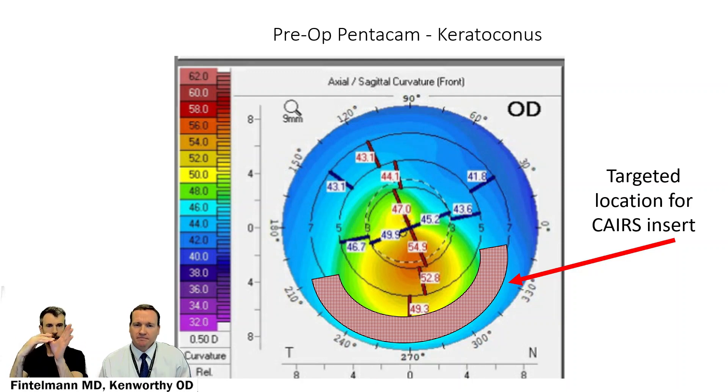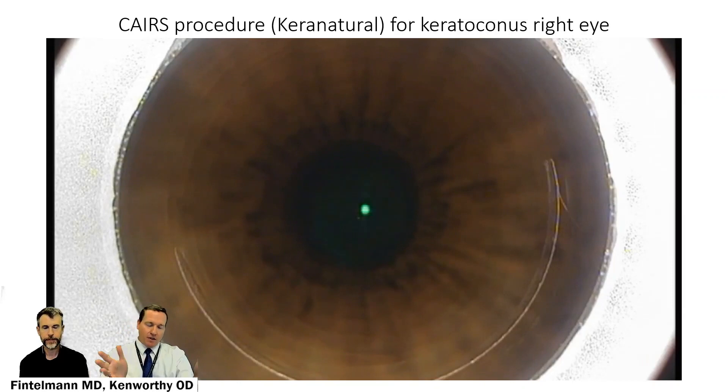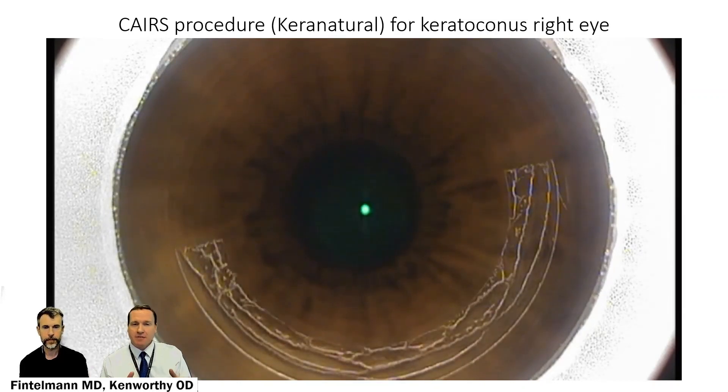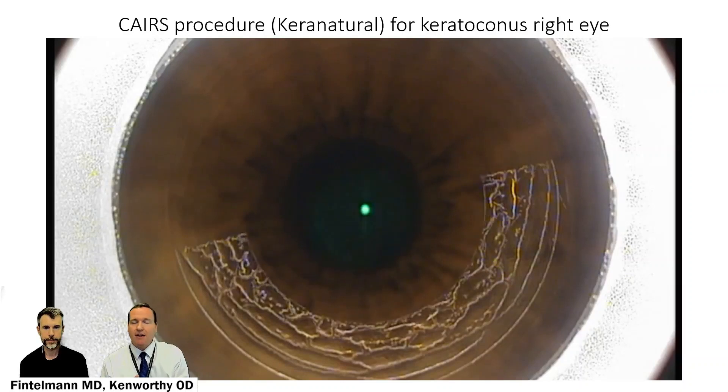If we support it almost like a push-up bra with a segment, it can recenter the steepest part of the cornea and thus provide more correctable vision. What we're going to see is an intraoperative view of what this surgery looks like, starting with a femtosecond laser which is going to produce that arc-shaped channel.